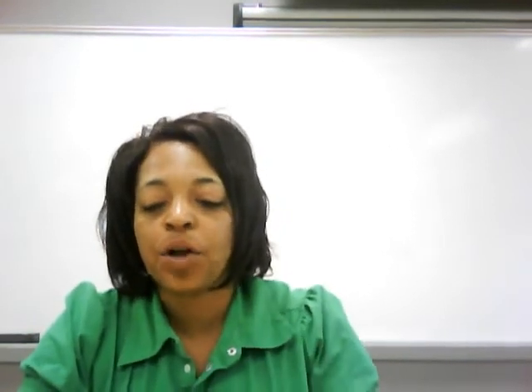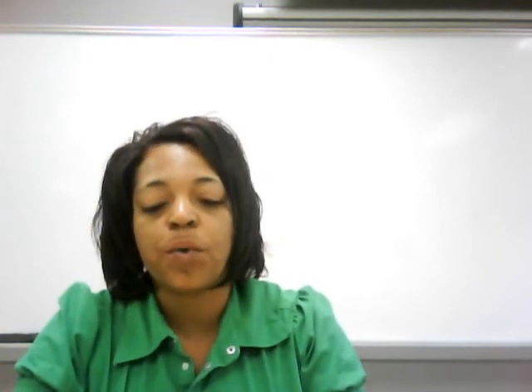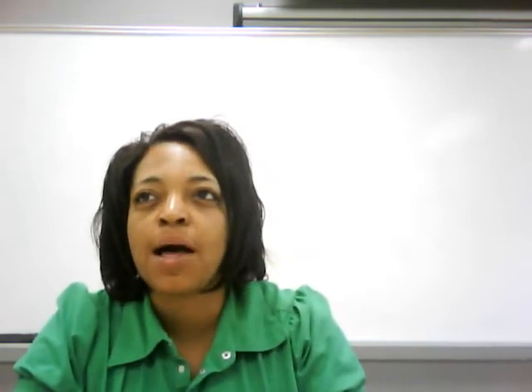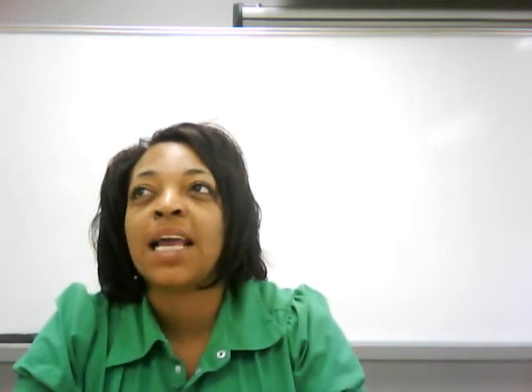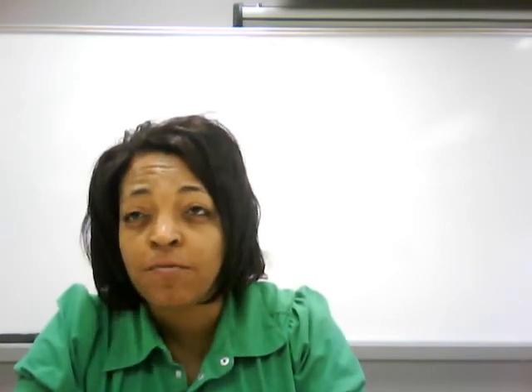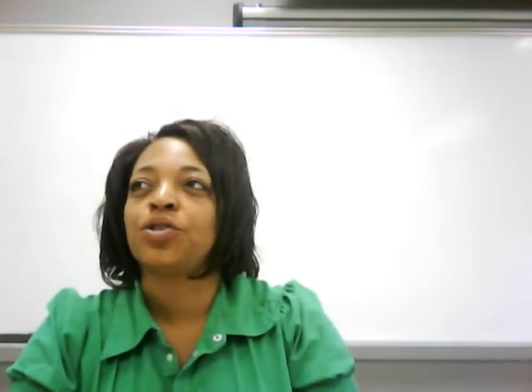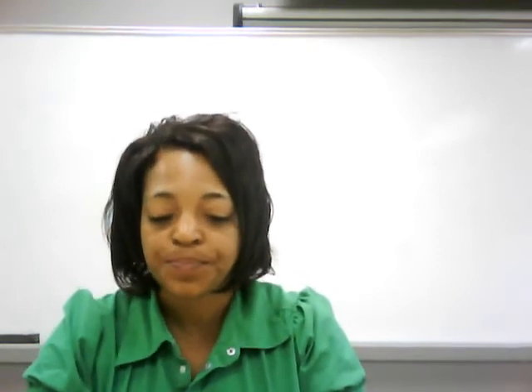Okay, another thing we'll learn about today is resolution. Resolution is what we're going to call the detail. Like, for example, if you look at a person's blouse and the blouse looks sort of wrinkled, or if the blouse has little small specks of dirt or a different color in it, well, if you can see those little small fine things about a person's blouse, then that will be considered your detail, or in other words, what we're going to learn today, your resolution.